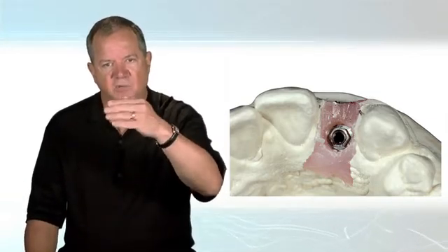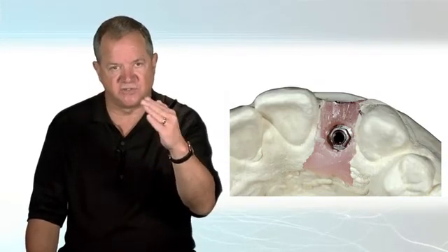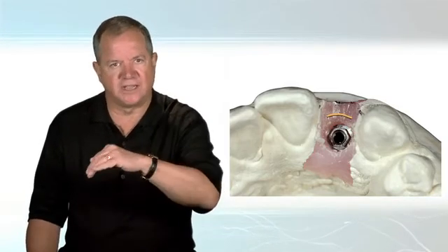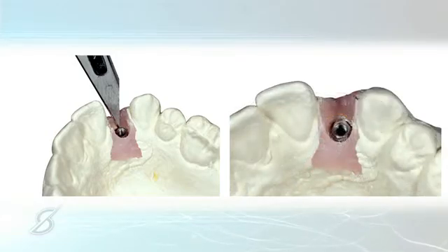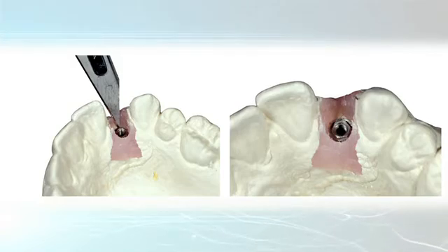I'm going to take away from the inside, leaving about 1 millimeter thickness of gingiva sitting on top of the restoration. Again, you can do it with a sharp blade or with a high-speed diamond. So we carve that away, and now we have our contour for our final gingival form. Now we're going to put our temporary abutment on, and then typically using some kind of pre-made matrix from a wax-up, we'll just load it with our temporary material and seat it right over the top of this.